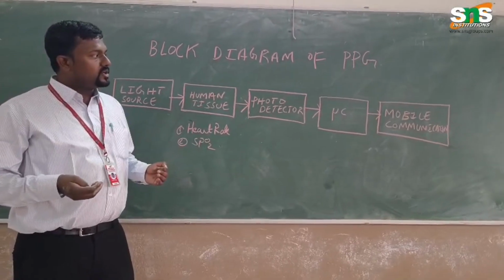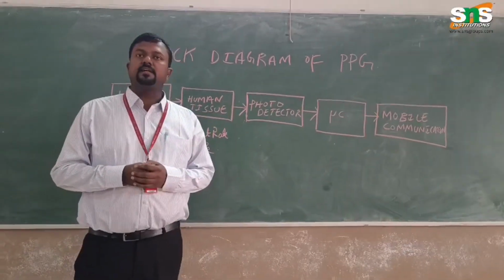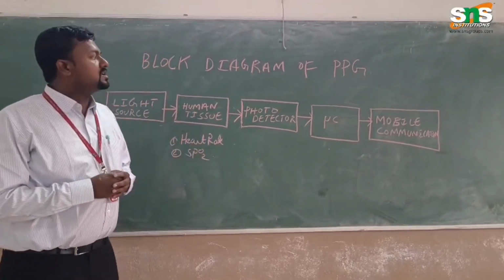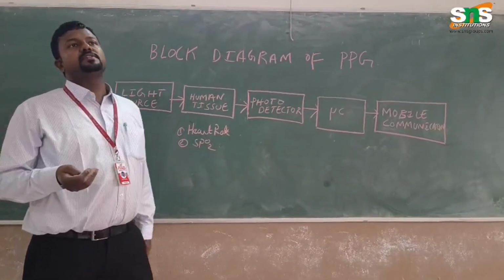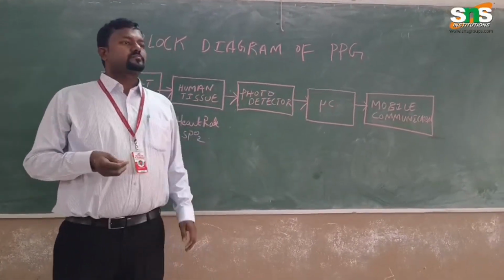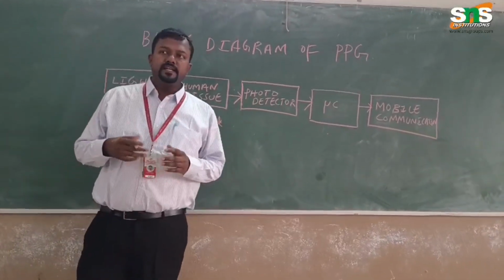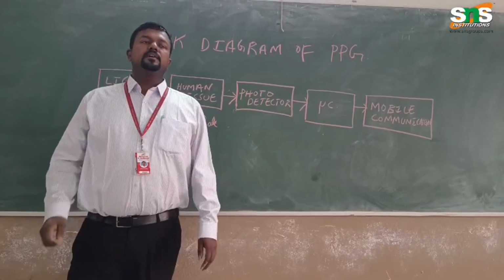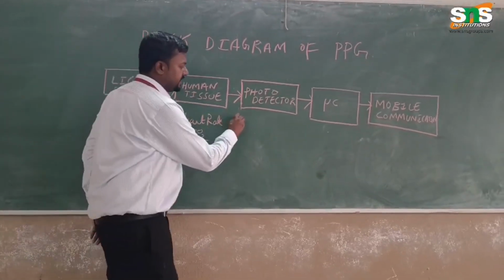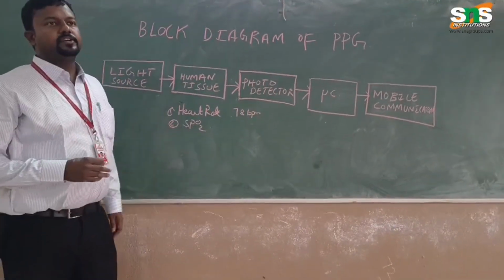So these nano level signals have to be sent to the amplifying circuit or the signal conditioning circuit to convert them into a proper, readable format. This conversion takes place in the signal conditioning circuits. Because when we speak about the PPG device, as everyone knows, the display will be in the form of the normal heart rate of a person. Suppose the normal heart rate of a person is 78 BPM. It can go up to 78 to 90.